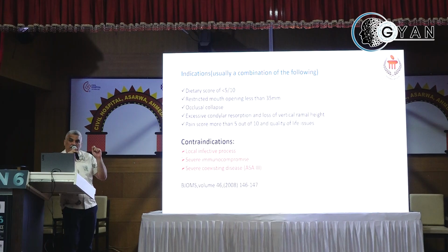Are we looking at every molecule of the joint which is taken into consideration? How far is it pure titanium? That's Ti6Al4V. Are we looking at alloys of titanium which are incorporated into the TJR? We as a country, do we have a prosthesis which is purely titanium, or are we adding alloys which will have a failure in 20 years or in 2 years?